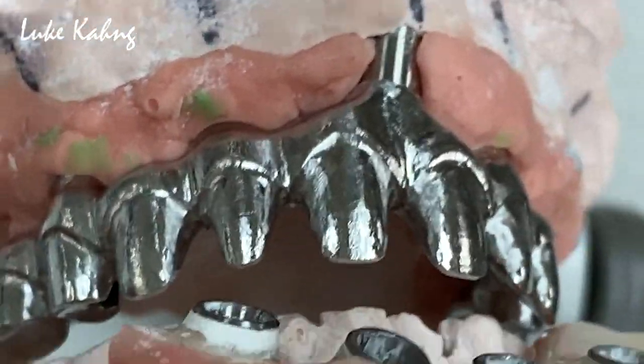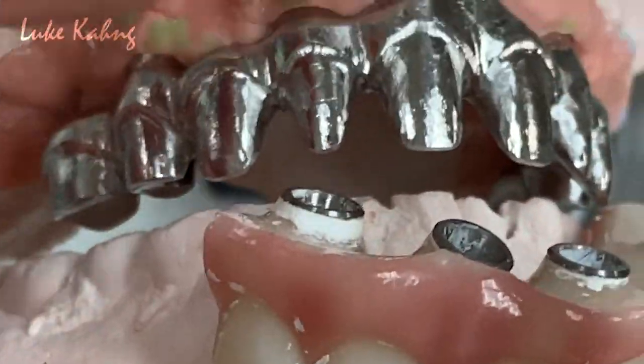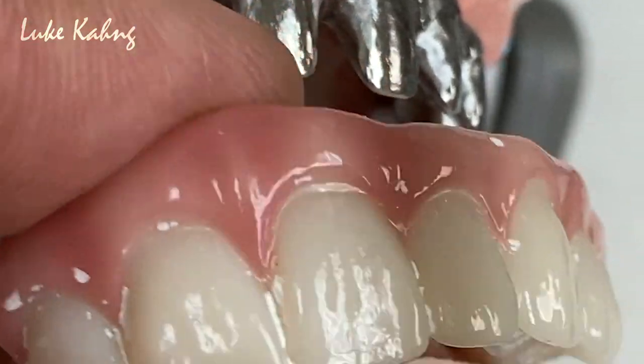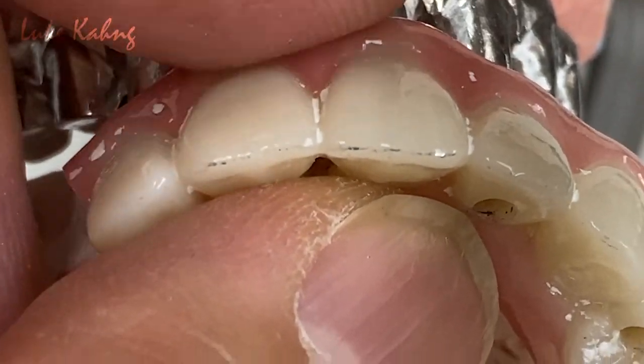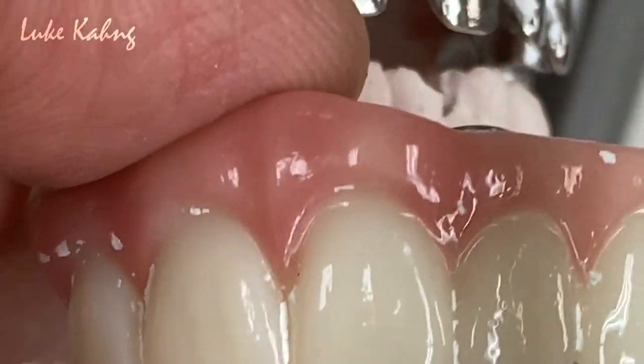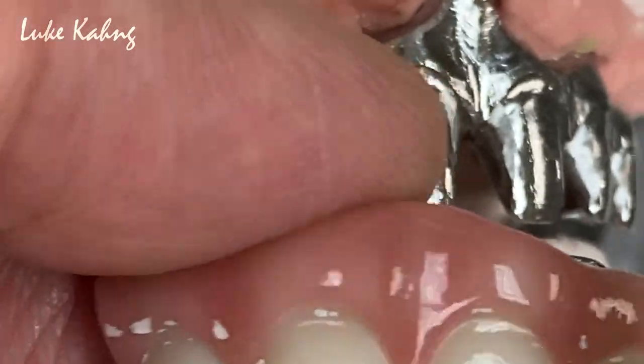We're going to correct it. It's not only aesthetic, and the doctor says there are more problems here. And I really don't like this kind of contour. It's really bad, it's artificial looking. The monolithic, they just painted.